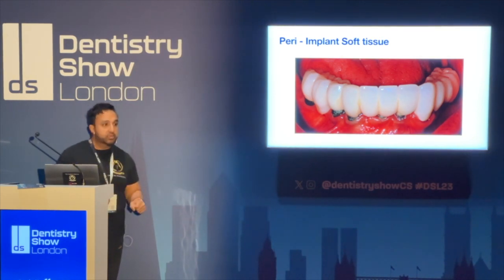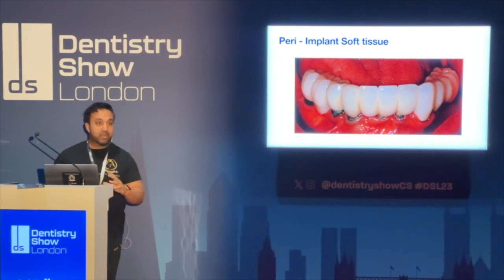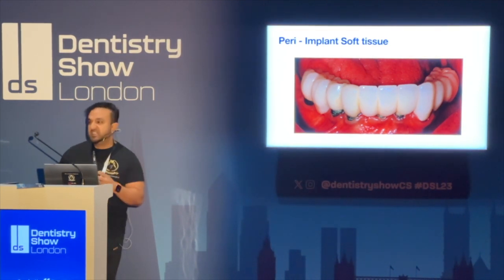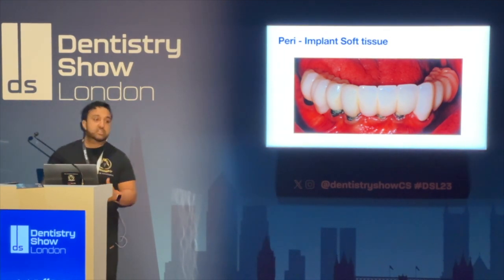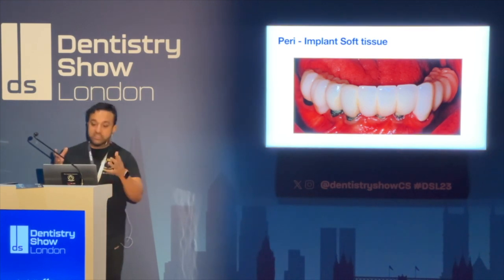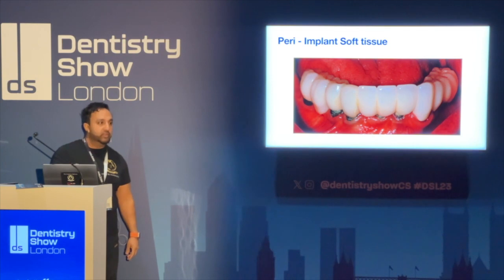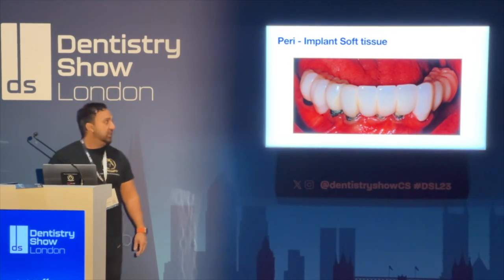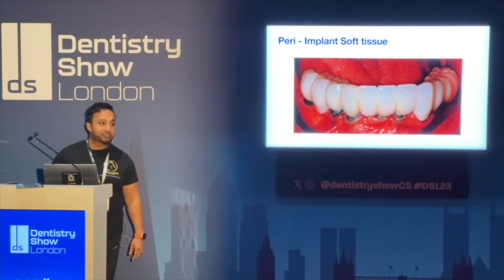We've got a muscle pull that we're seeing. We haven't got much thick biotype around the implants, and what implants like is thick biotype. So as the surgeons that do this sort of work, we do a lot of soft tissue grafting. We change biotypes, but if you see this situation, this is partially due to the actual muscle pull that you can see over here on this picture, that's caused the recession on the implants and exposure.